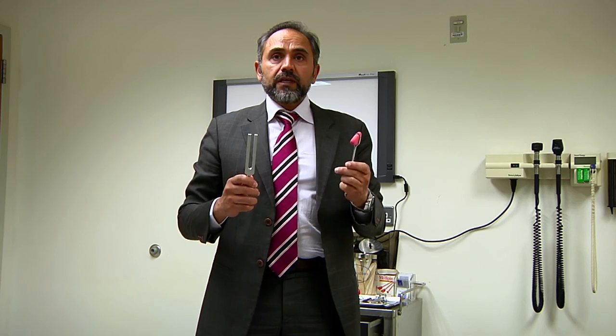And I think in any society where we have a high prevalence of diabetes, the minimum we should be doing is looking for early signs of neuropathy to prevent the long-term complications. So the assessment of diabetic neuropathy is clearly important, and traditionally we would use instruments like this, which would allow you to assess the reflexes, or this, which is a tuning fork, which allows you to assess vibration.